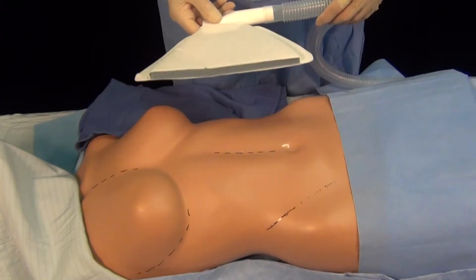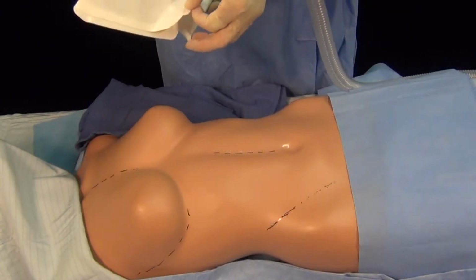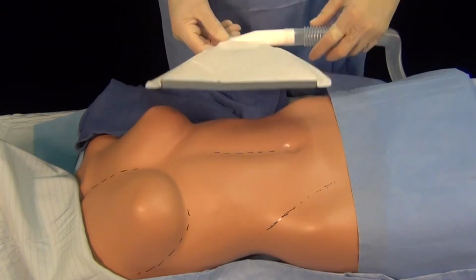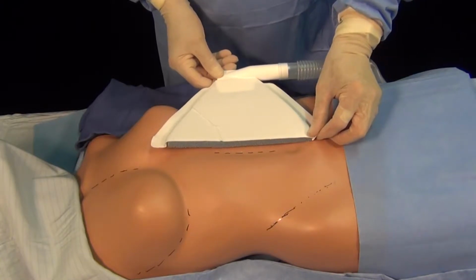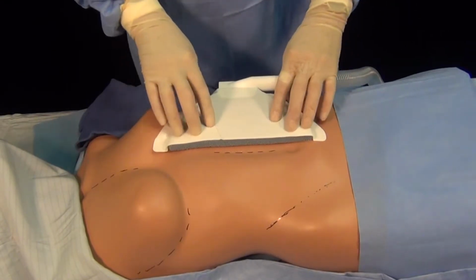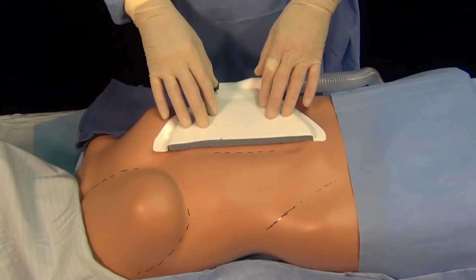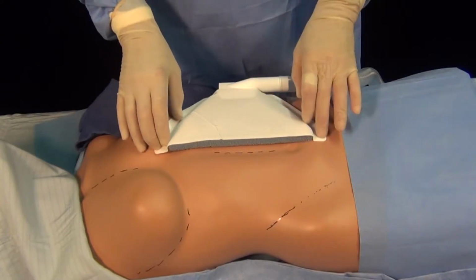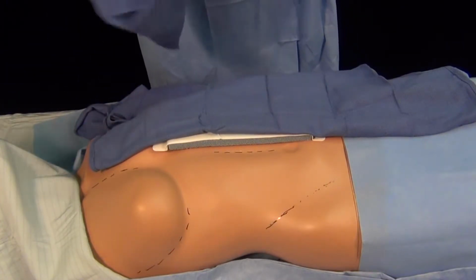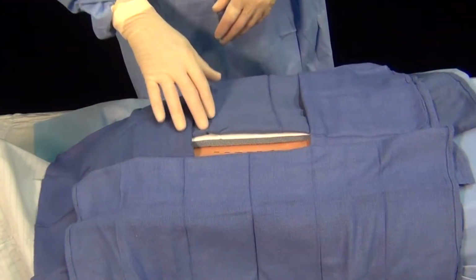The second incision that we're going to apply the miniSQUAIR adjacent to is the midline incision. Again, remove the release paper, very sticky surface, and you put it on as close to the line of incision as possible. Press it in, and again, it is put on the dried prep skin, on the surgical barrier drape, or on top of the outer surgical drape, depending upon the preference of the surgeon. You can square off with the towels. And your surgeon is ready to go.